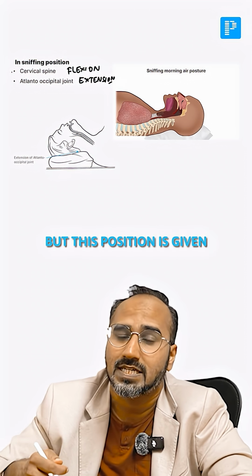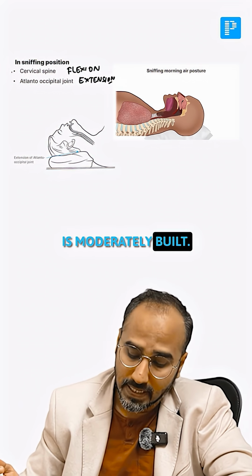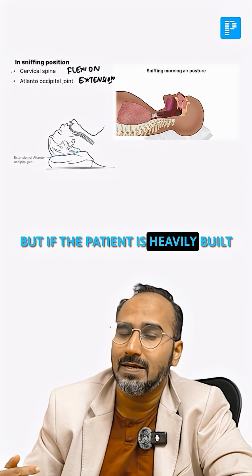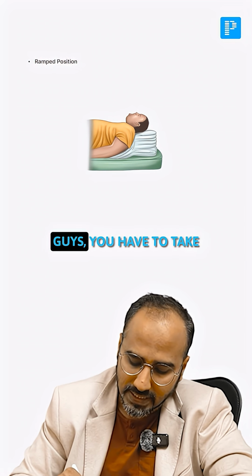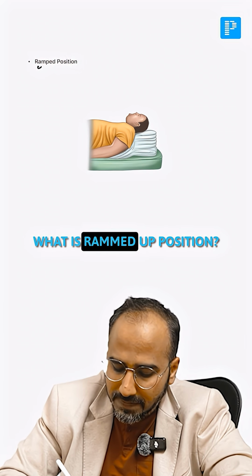But this position is given when a patient is slim or moderately built. But if the patient is heavily built, or if the patient is obese, you cannot take that position, guys. You have to take which position? You have to take a ramped up position. What is ramped up position?